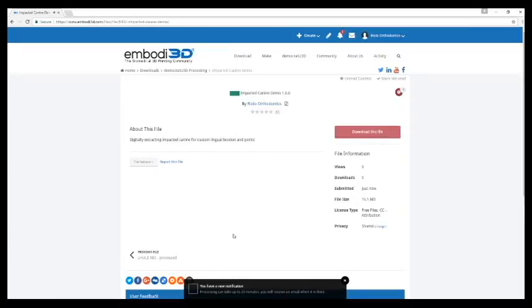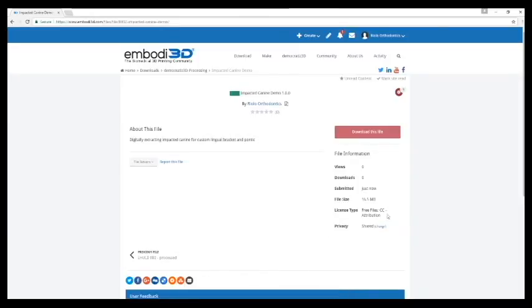So then you will see a little notification down here that it only takes up to 20 minutes for you to receive the STL file back and processed. It's really quick. It usually doesn't even take 20 minutes.